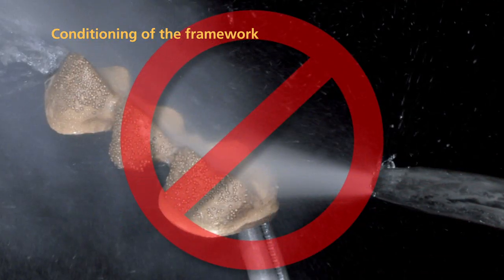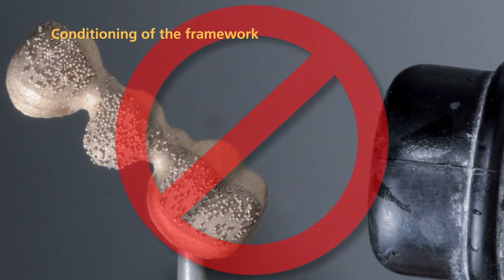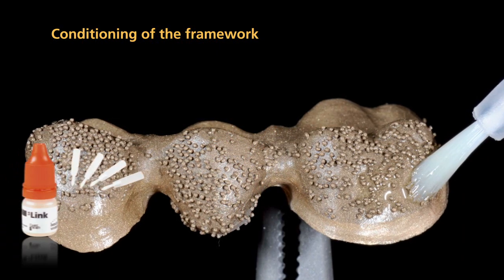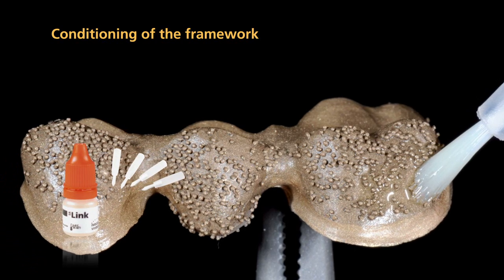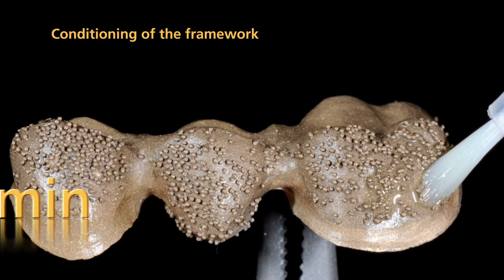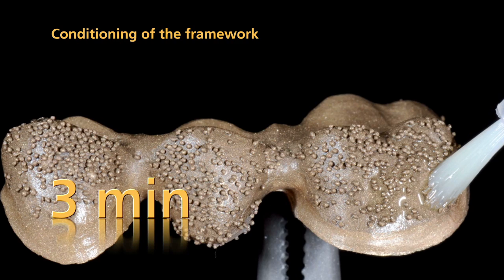After blasting with aluminum oxide, do not clean the framework with steam or an air gun. Immediately after having tapped off the residue, apply SR-Link bonding agent using a disposable brush. Please note that SR-Link should be allowed to react on the metal surface for 3 minutes.